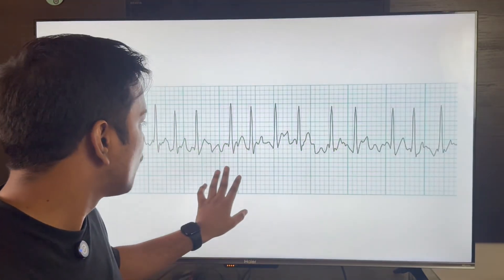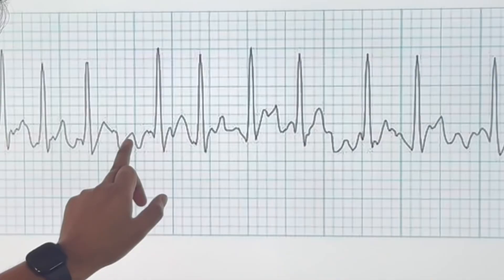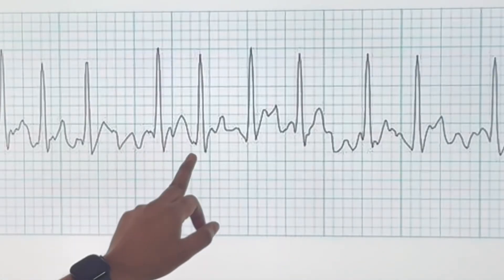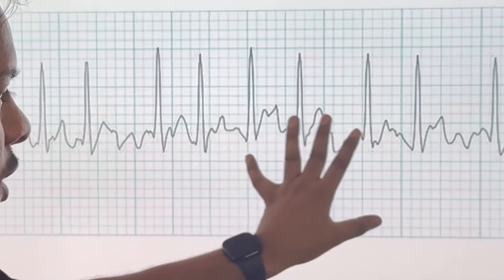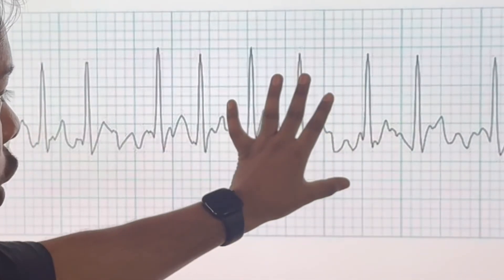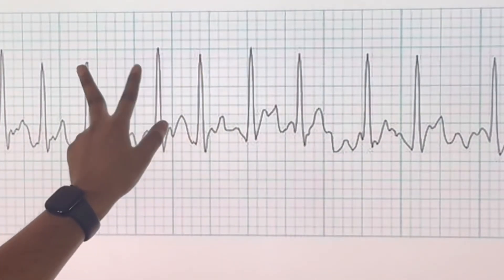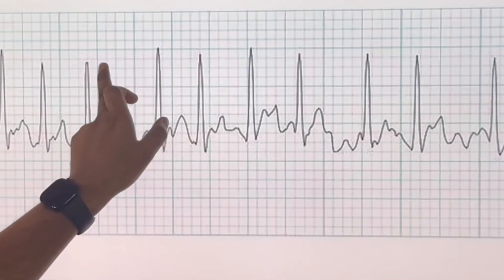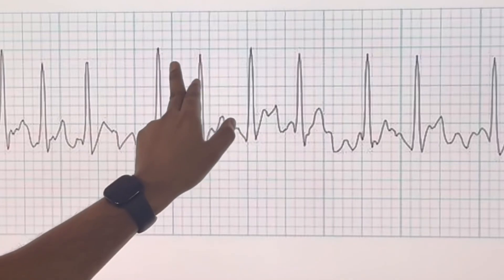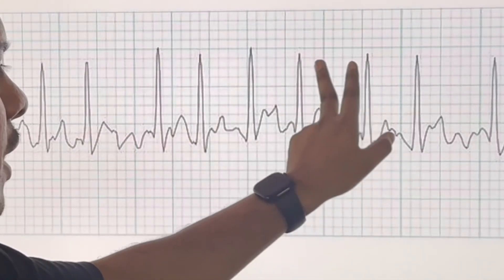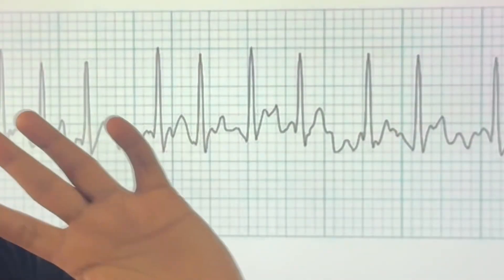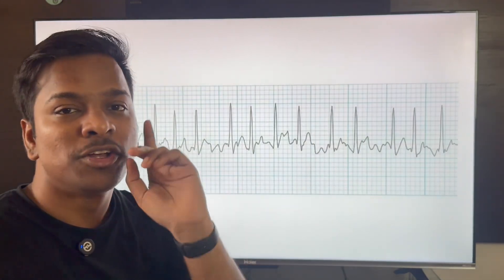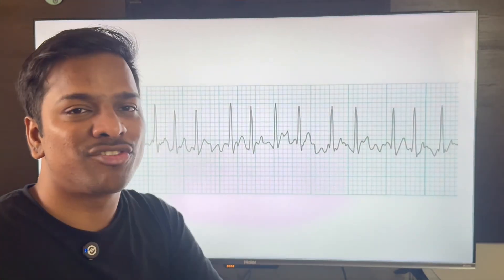In this ECG, there are no discernible P waves, and the RR interval is irregular — here we see two boxes, then one box, then one box, then two boxes, then three boxes. Since P waves are absent and RR is irregular, this has to be atrial fibrillation.